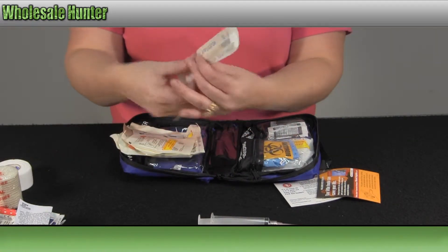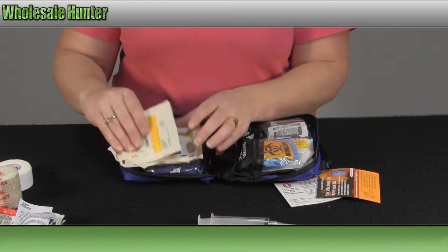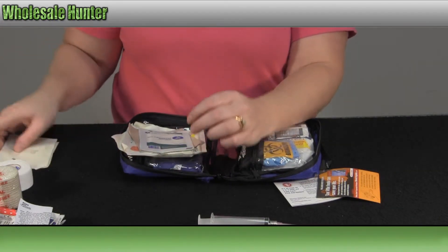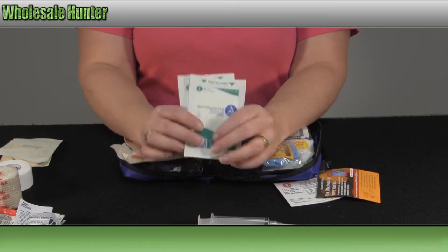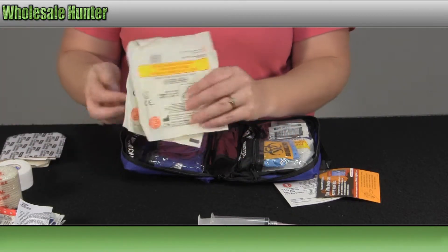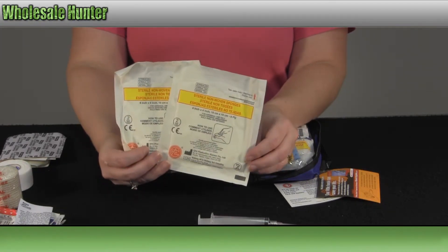You have two of your cotton tipped applicators, two of your 2x2 sterile nonwoven sponges, two of your non-adherent pads, a sheet of moleskin, and two of your 4x4 sterile nonwoven sponges.